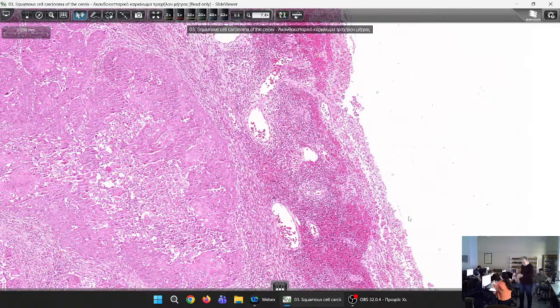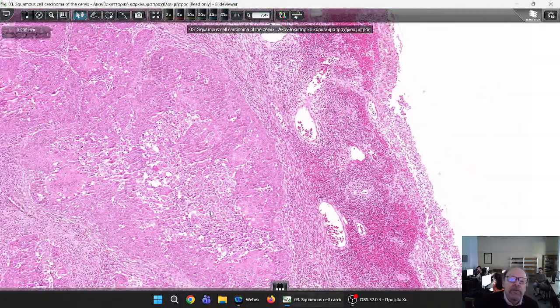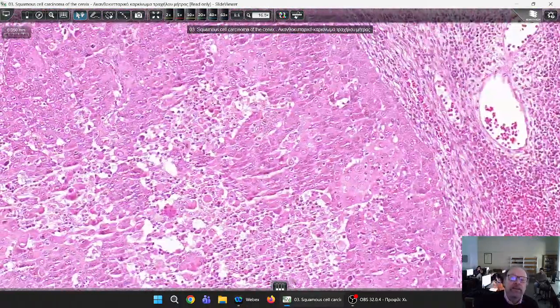Yes, please. Dyskeratosis is keratinization in single malignant cells. And how do they appear? Since they have entered the apoptotic process, the nucleus is very shrunken and hyperchromatic, and the cytoplasm is too pink, too oxyphilic. It's somehow bright. So that is dyskeratosis, and it is evidence of keratinization, very helpful in poorly differentiated carcinomas.